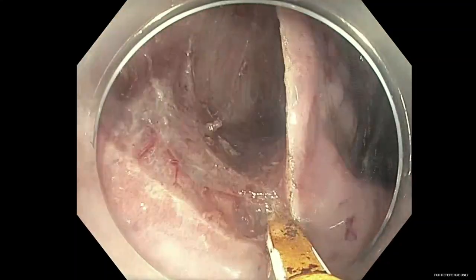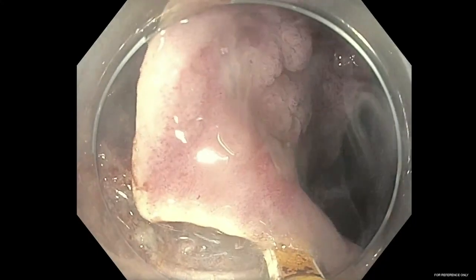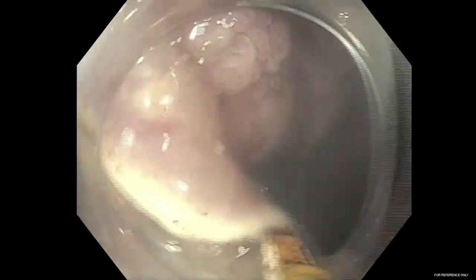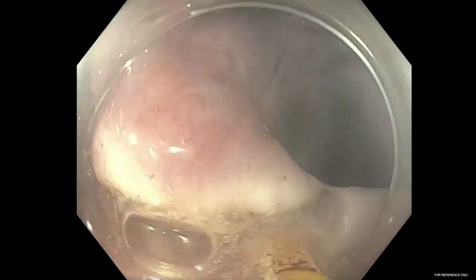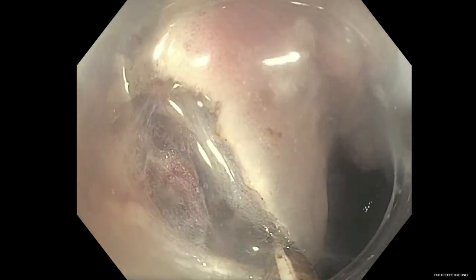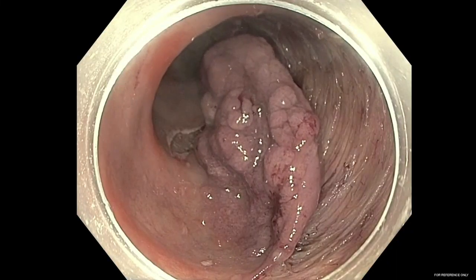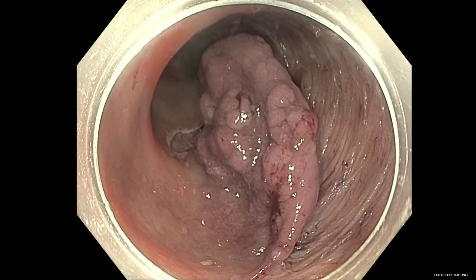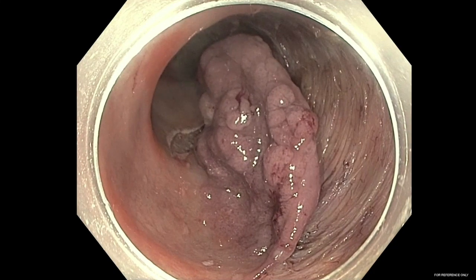Here in this video, we highlight the lateral mucosal incision and submucosal dissection to the open tunnel. It is important to understand that this was started from the gravity or dependent side. If the endoscopist begins from the anti-gravity side, the mucosal flap will flip over and make the dissection on the dependent side much more challenging. We see a nice overview of the target lesion hanging down in a gravity-dependent manner from the mucosa left intact.